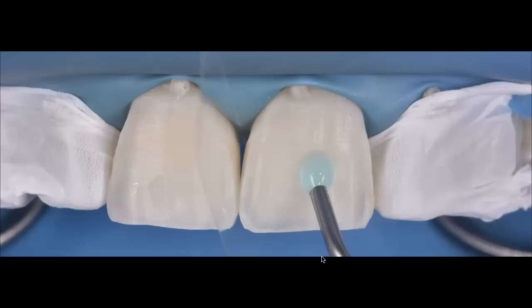I personally like doing one by one so that I can do what I call a pre-finishing of one restoration, so I can get the right length and the right width. And that would allow me just to replicate that when I do my second restoration. So that's the reason why I like doing them individually. But again, this is all up to you.